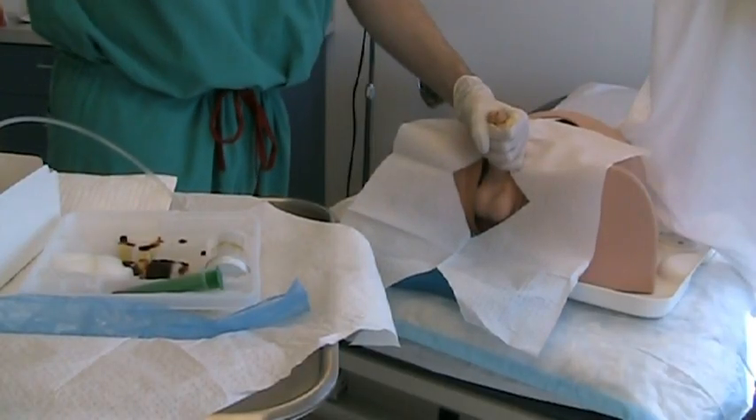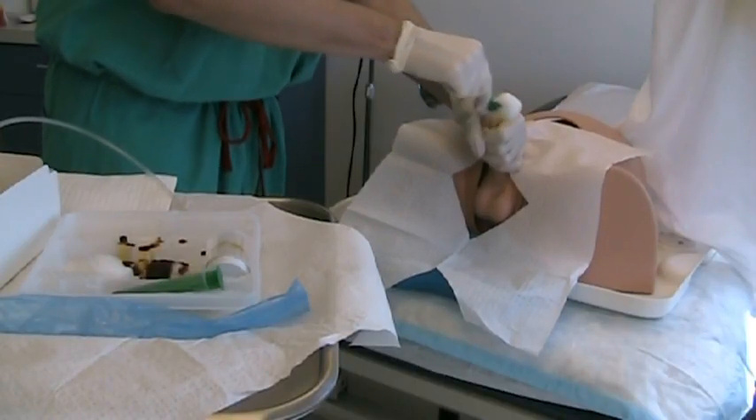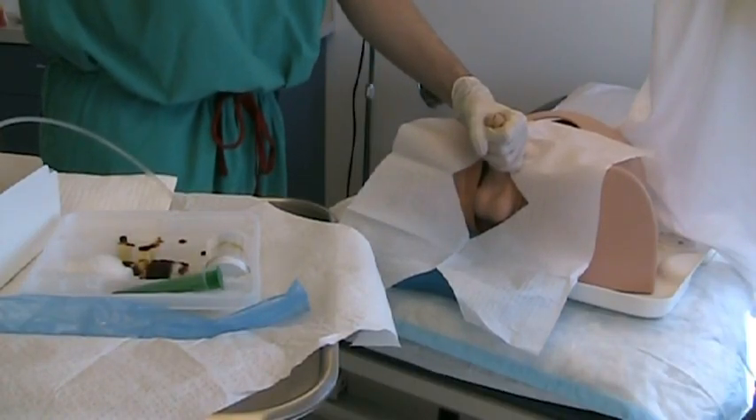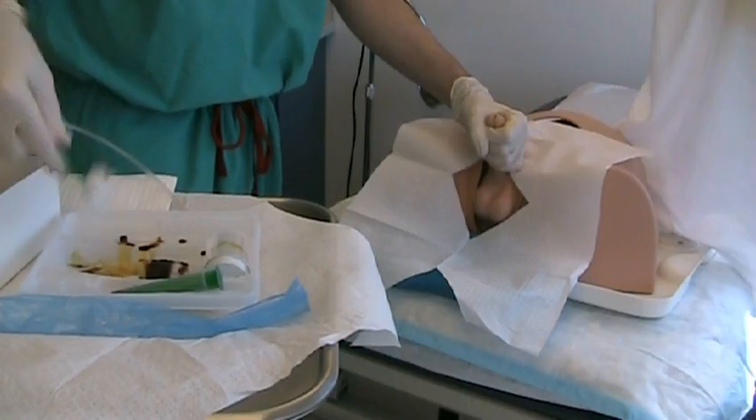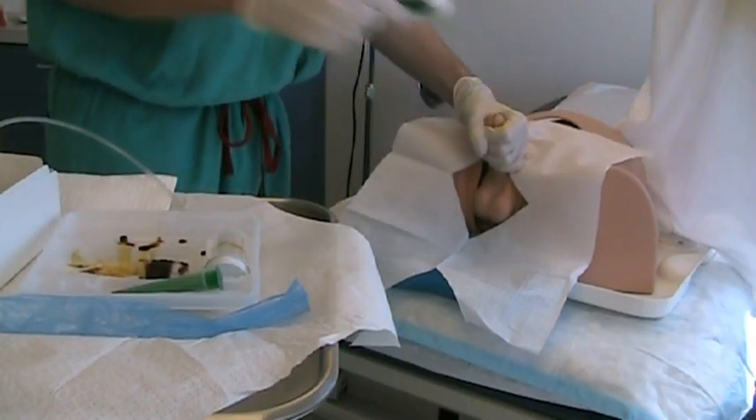The head of the penis is cleaned with the cotton balls covered in betadine. At least three cotton balls should be used. After cleaning, the left hand is no longer considered sterile.